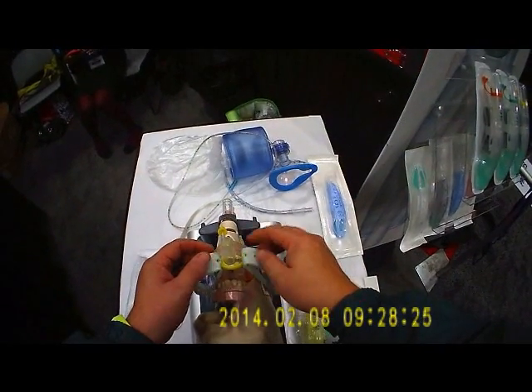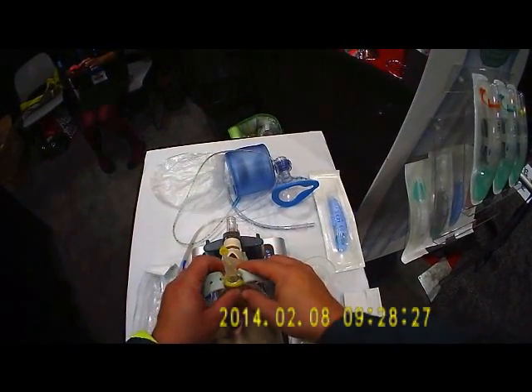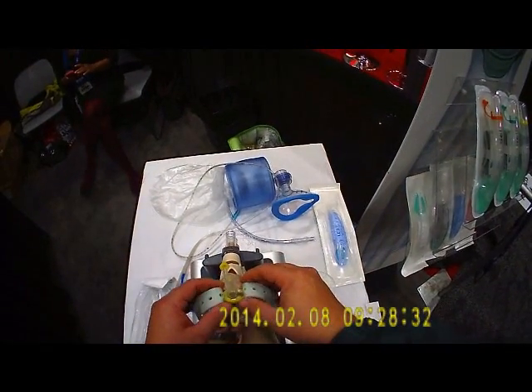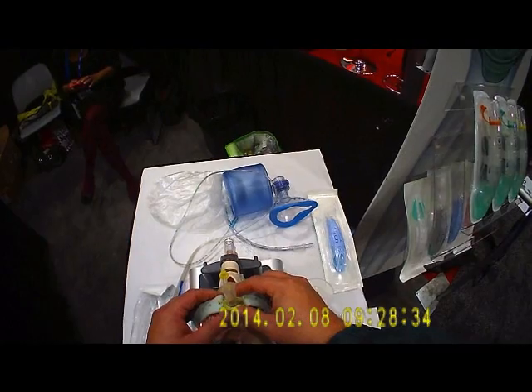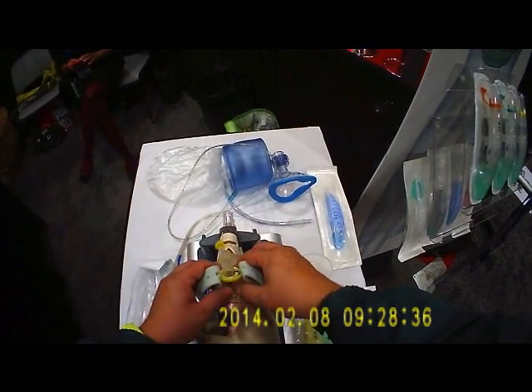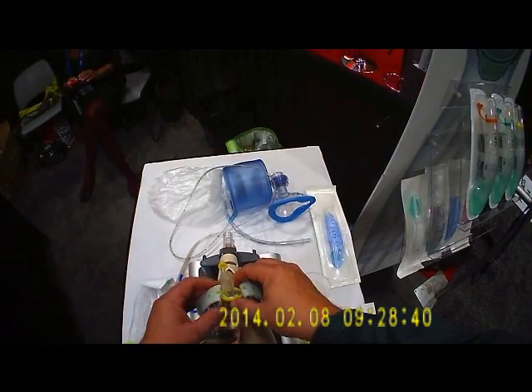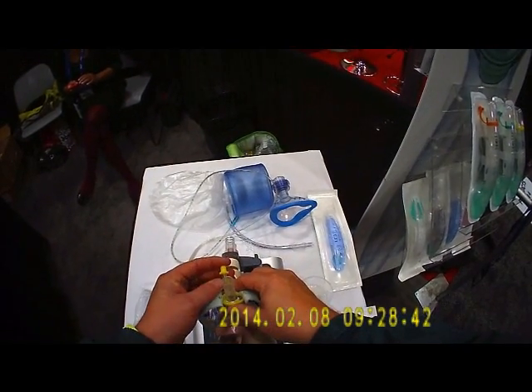When it comes time to transition to an endotracheal tube, it's as simple as sliding the appropriate size endotracheal tube through it and inflating the cuff — you're good to go. I think this has a lot of potential, and I'm going to try to bring it to the attention of my service's medical director and see what he thinks.